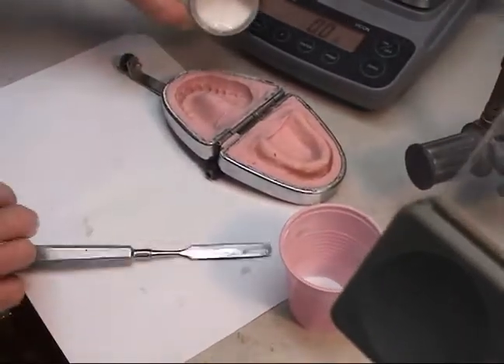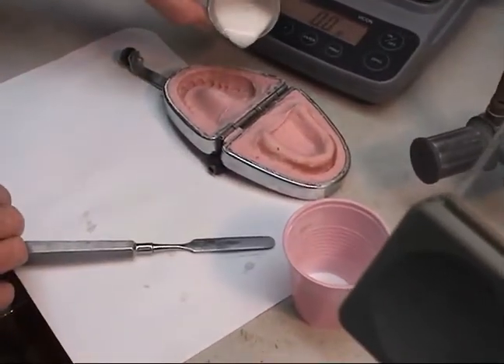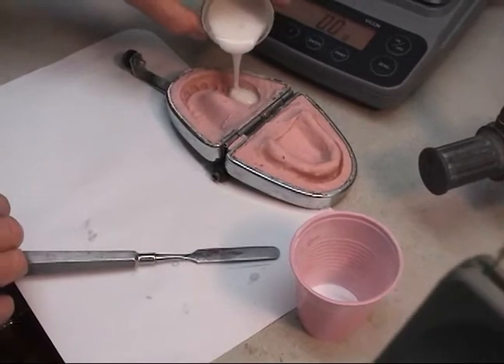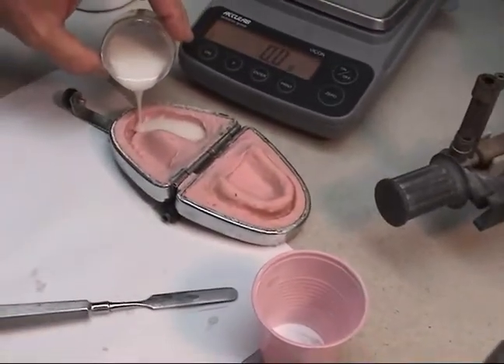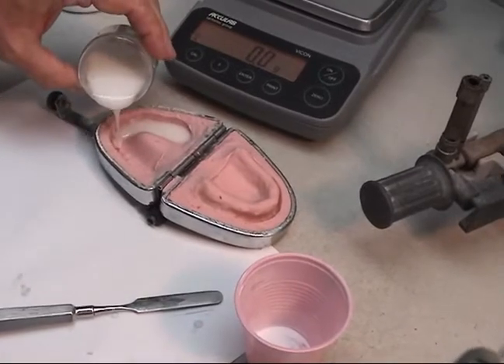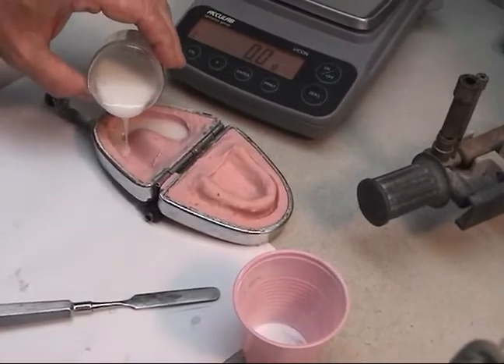The patient's existing denture was duplicated in a denture duplicating flask using alginate as a duplicating material. The CT scanning appliance was fabricated by pouring acrylic resin into the mold of the denture in the duplicating flask.